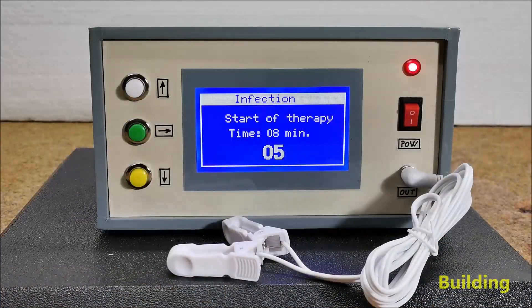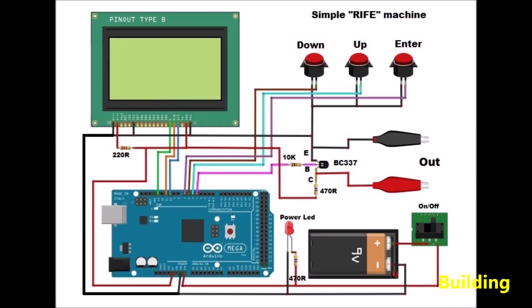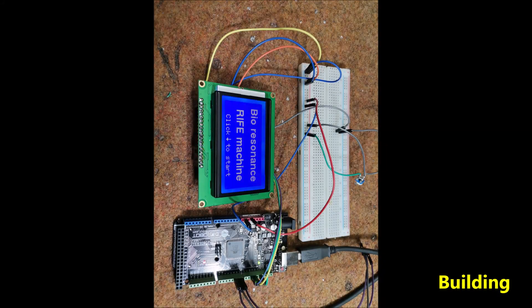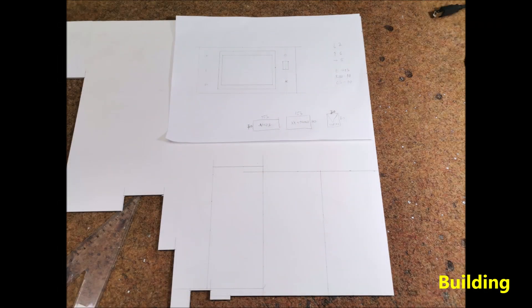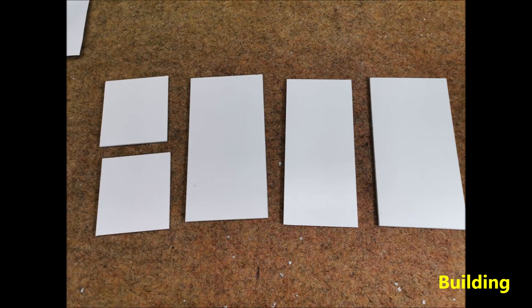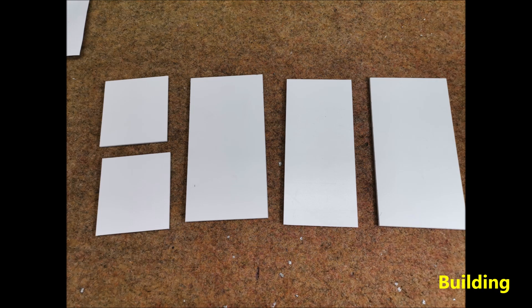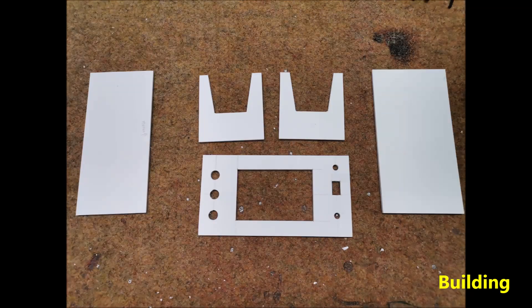And now let's briefly see how the device is made. Another example frequency shown is 840 hertz.